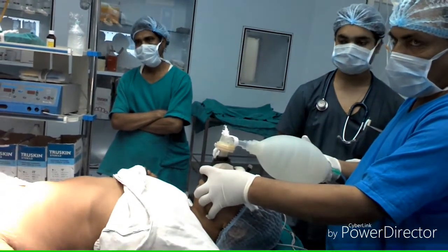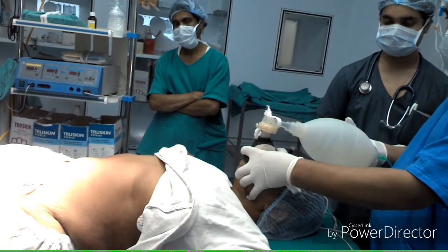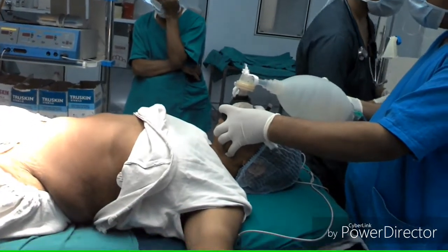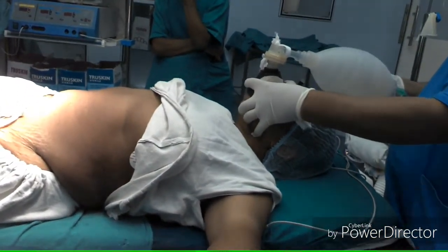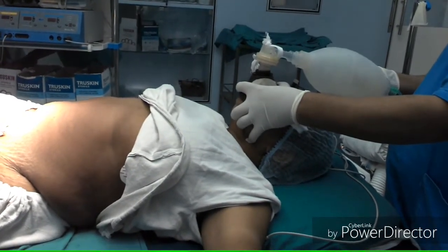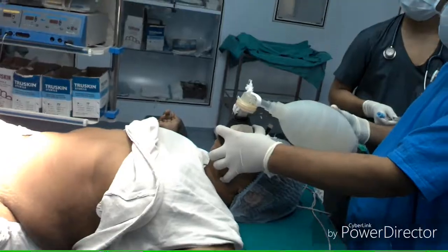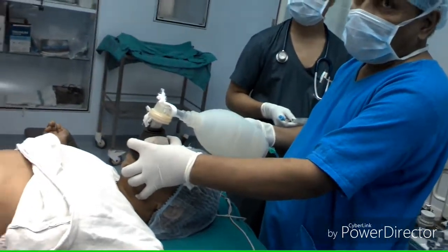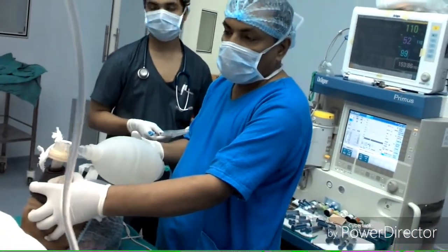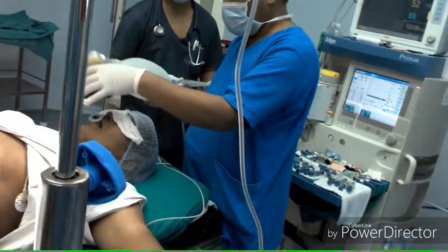During inspiration or compression of the bag, the inlet assembly valve and expiratory port diaphragm valve close and the fish mouth valve opens and air goes into the patient's lung. During expiration, the fish mouth valve closes and the diaphragm valve opens and air goes to the atmosphere through expiratory ports. During expiration, the bag expands and the inlet valve assembly valve opens and air comes into the bag.